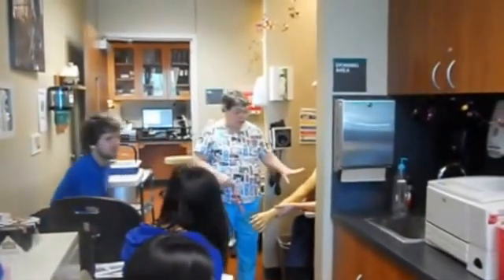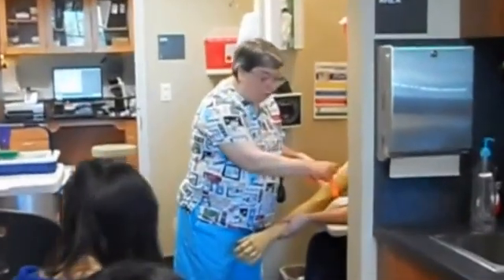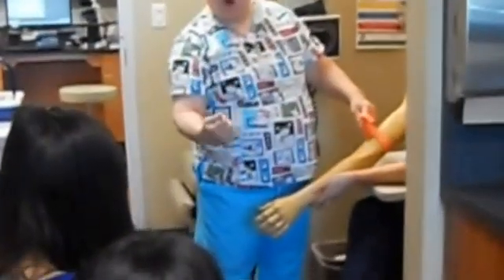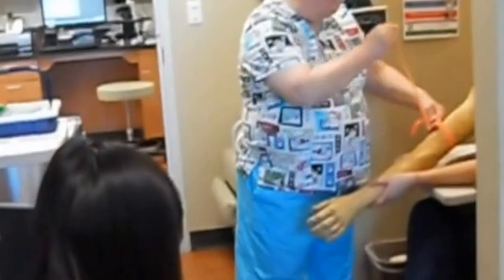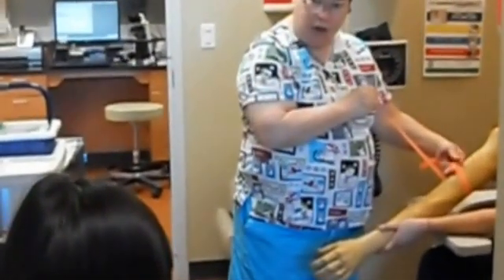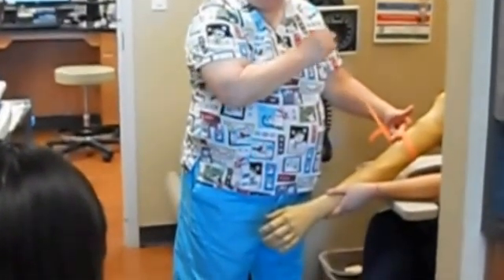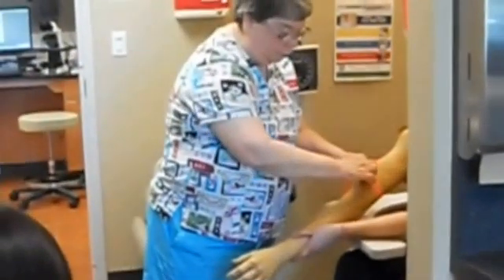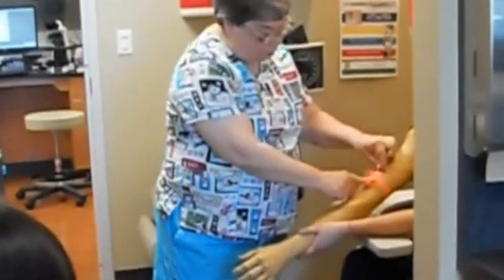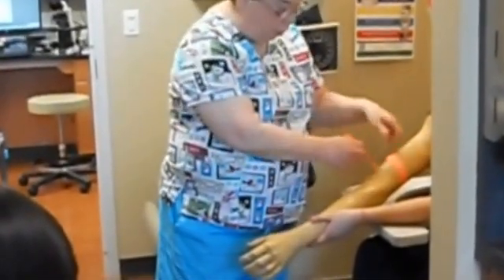Okay, so we have our arm here, we have our tourniquet. Put the tourniquet on, you want to make sure that the patient keeps their arm down while you pull up. And you take your left hand, if you're right-handed, pull with your right hand, and you want to keep 2 fingers from your left hand underneath the tourniquet. You want that much space free. And then flip it under so that you have the top part of the tab where you can pull it off. Okay?